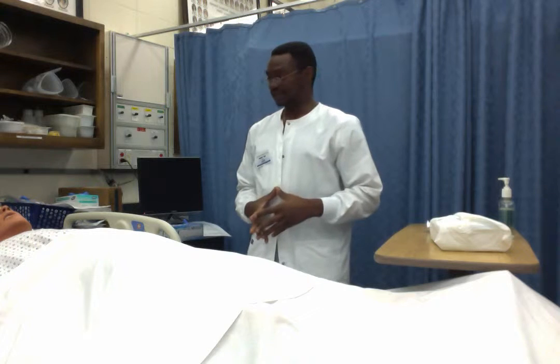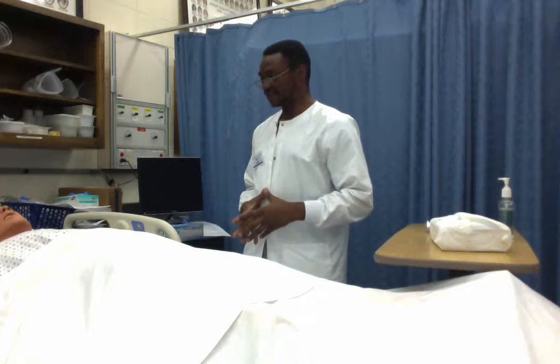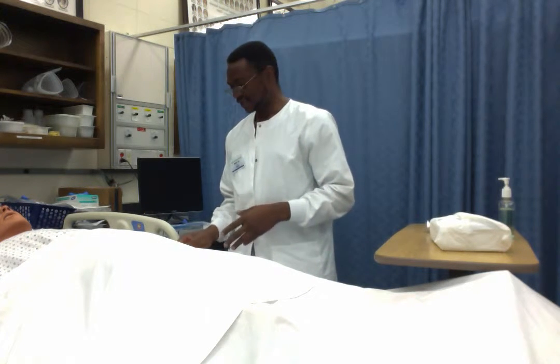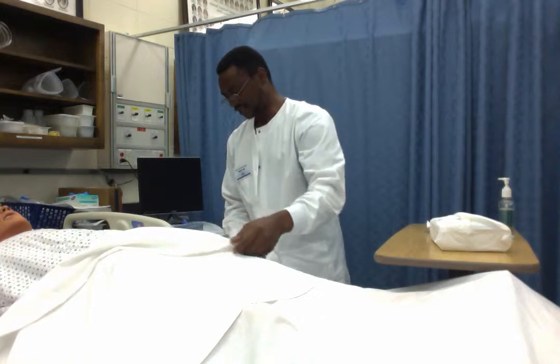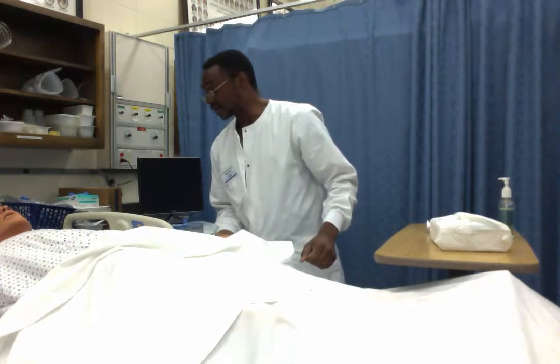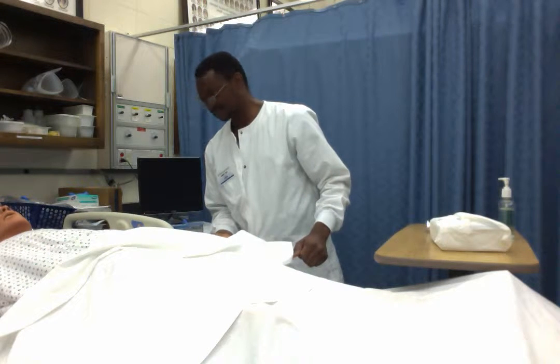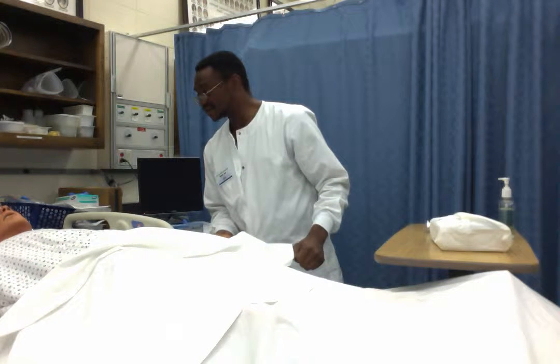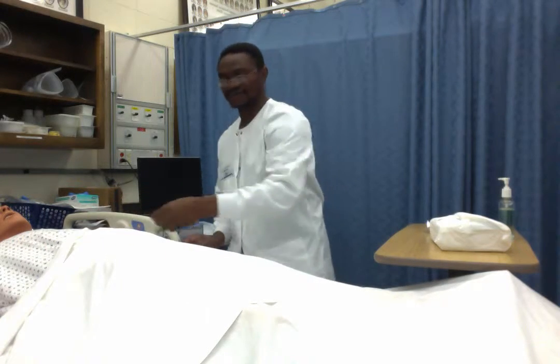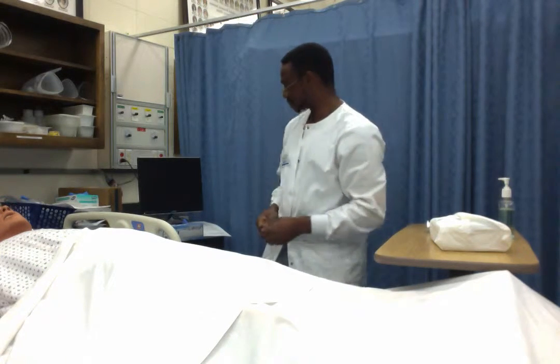So I will come to my patient, knock at the door, get in, introduce myself, and explain the procedure to him. Then I will identify the patient by verifying his wristband. And what is your name, sir? And your date of birth? And I have confirmed that this is the patient on whom I have to carry out the procedure. So I will now start the process.